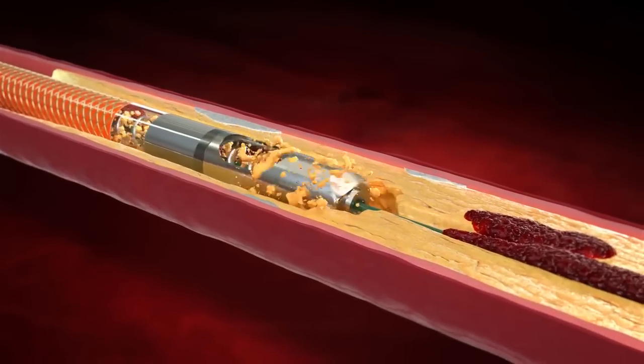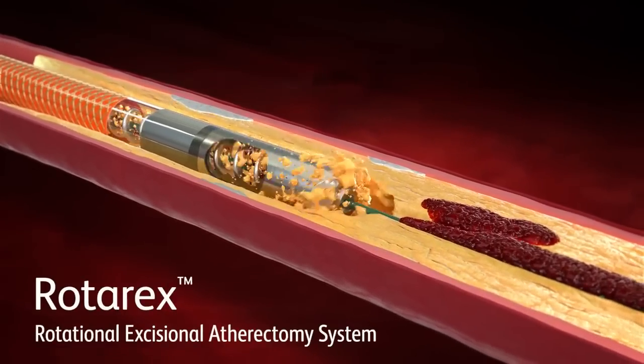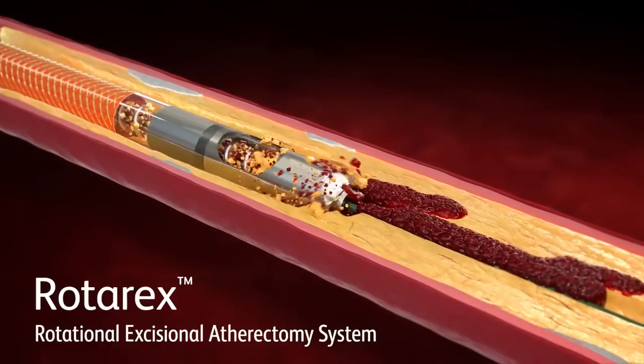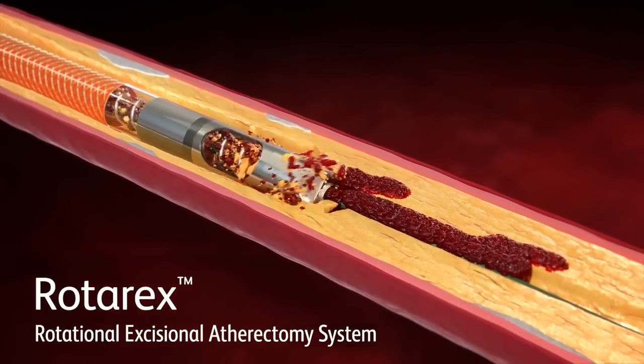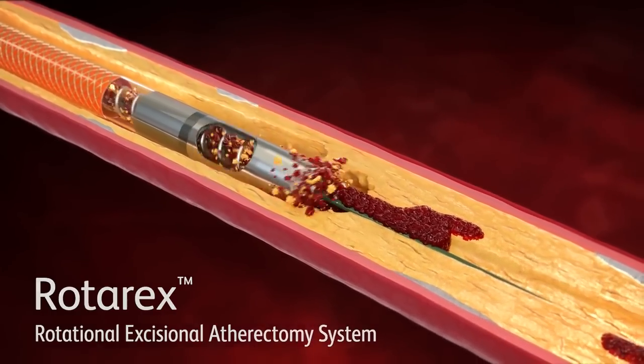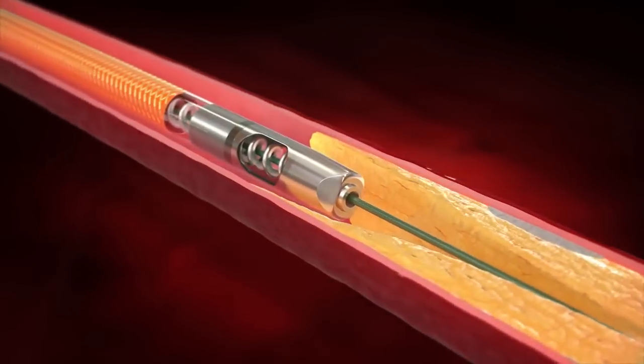BD is proud to present the Rotarex Rotational Excisional Atherectomy System. It is uniquely designed to help you address these complex challenges. The Rotarex system is dual-indicated for both atherectomy and thrombectomy applications. Here's how it works.